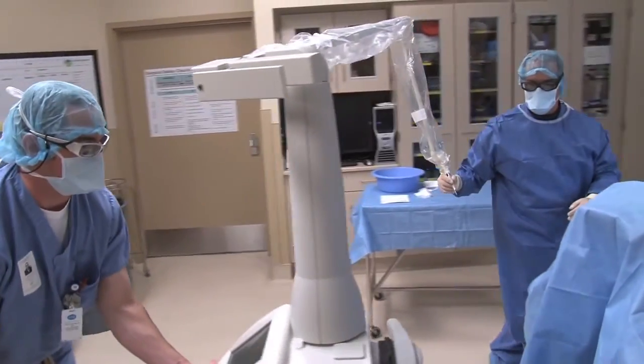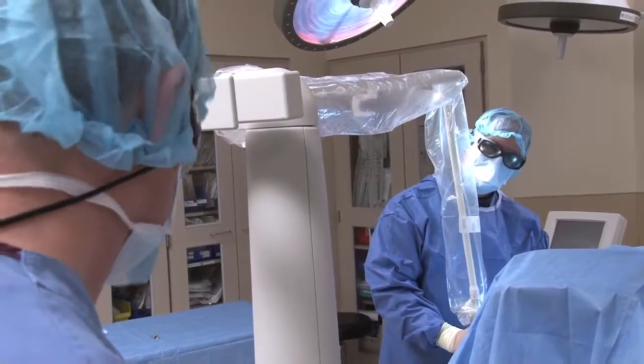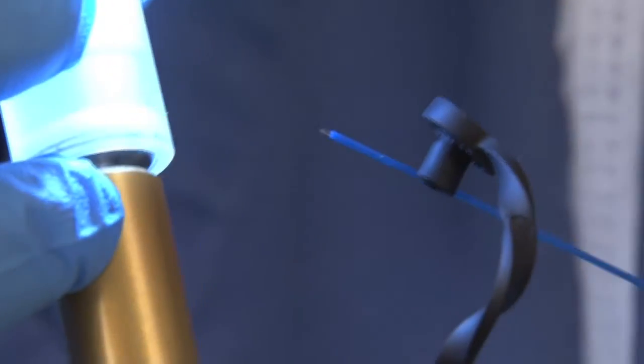In order for a laser to function properly, prior to a case, the laser technician must inspect and maintain the laser's optical devices to ensure they are clean and in proper alignment.